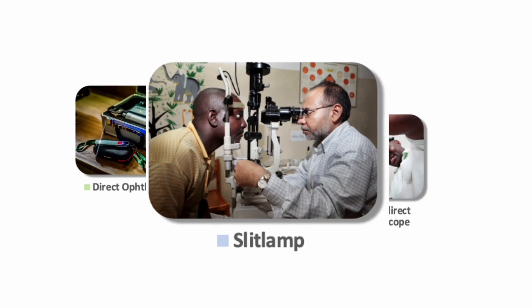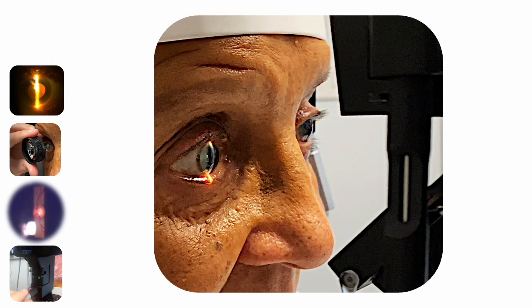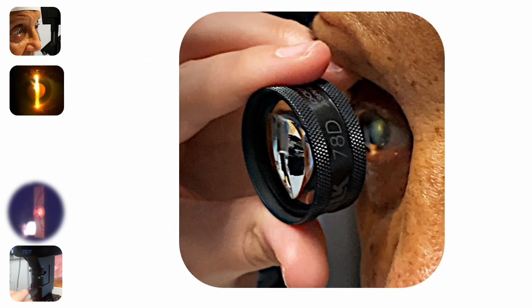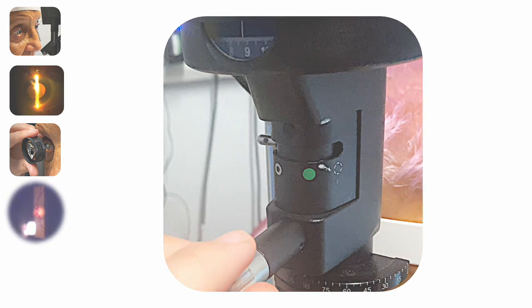When using a slit lamp to examine the macula, position the patient so that their eyes are at the same level as the black mark on the vertical bar and their head is forward leaning against the forehead strap. Line up the light source and eyepieces to create axial illumination. Use your fingers to brace the position of the lens and hold the eyelid up to reduce blinking. Ask the patient to look slightly temporally towards your ear. The optic disc should come into view. Adjust the tilt and distance of your lens and the beam brightness, width and height to improve the view. Then move temporally to find the darker area of the macula.